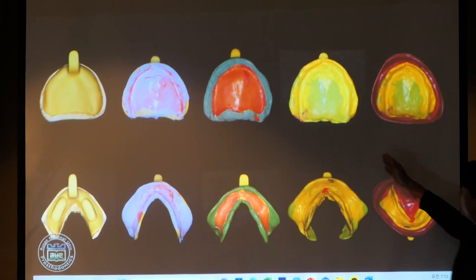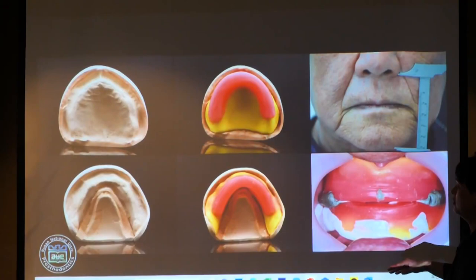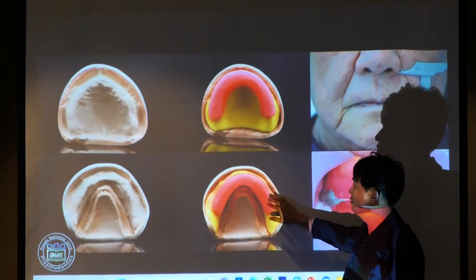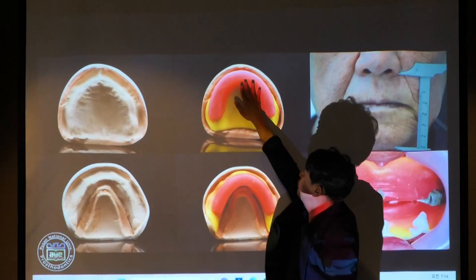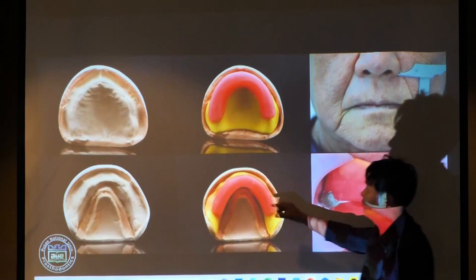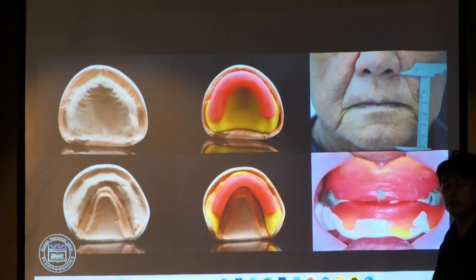In your clinics, this step is finished, right? And then you send it to the dental lab. The dental technician has to make the occlusal wax rim like this, based on the average value, based on the reference points: the retromolar pad, the incisive foramen area, and the depth of the vestibule. Those things are needed to make the proper occlusal wax rim. But is it right? Is it correct?